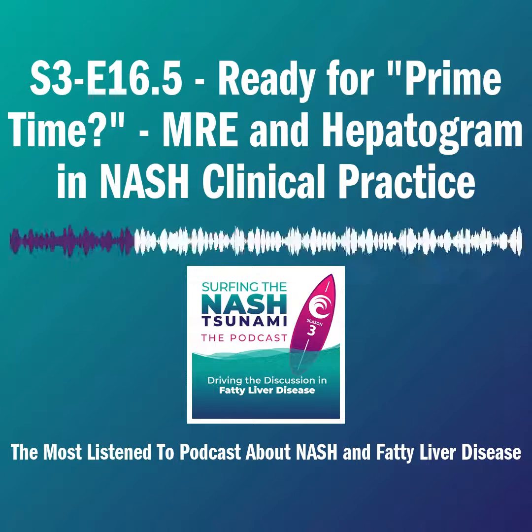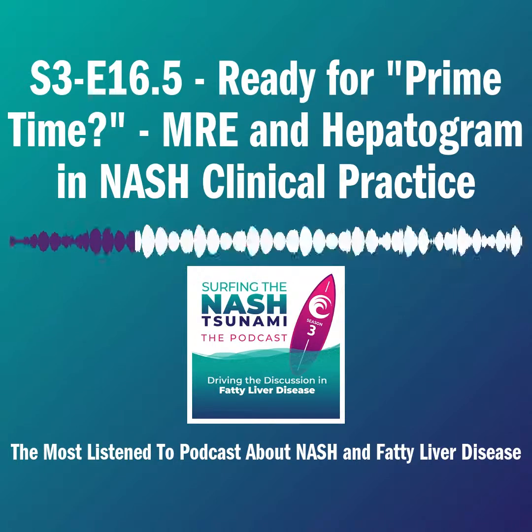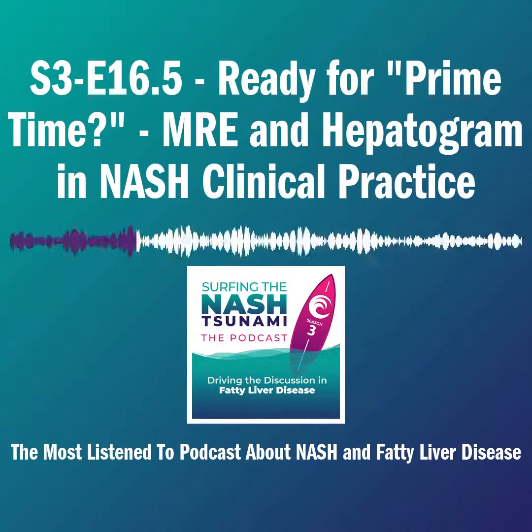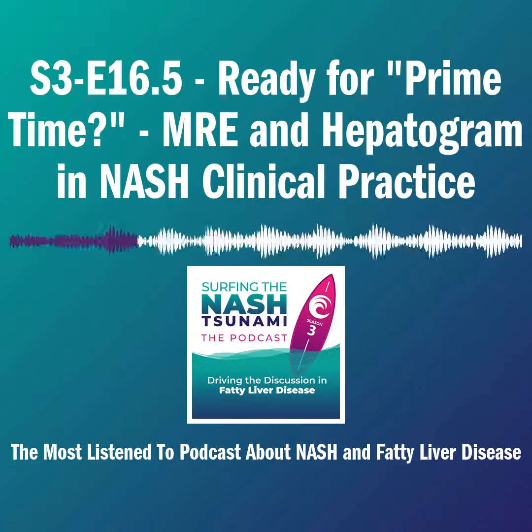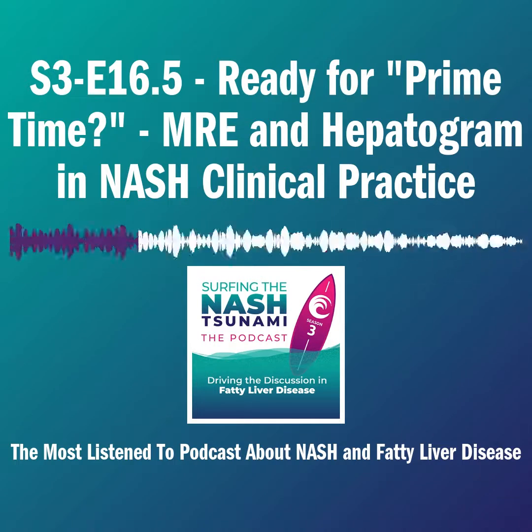The last thing I'll mention, and I will stop here, is that in this score, MRE plays a significant role. So some people say, well, it's probably the AST, which we think probably the FAST score depends a lot on AST and can change with it. No, with that score, MRE is probably the main driver, followed by PDFF and then AST the least. So with that, I'll stop and let other people talk.